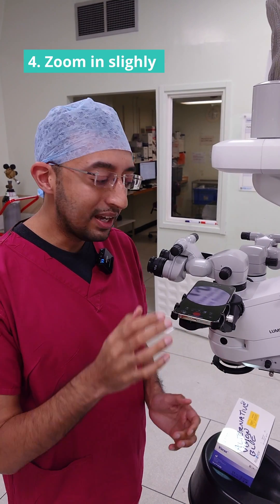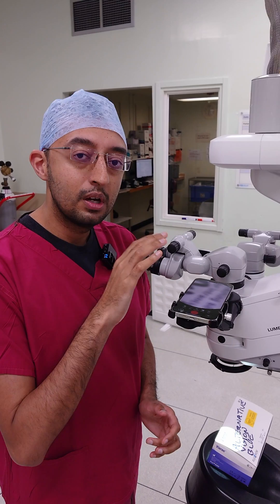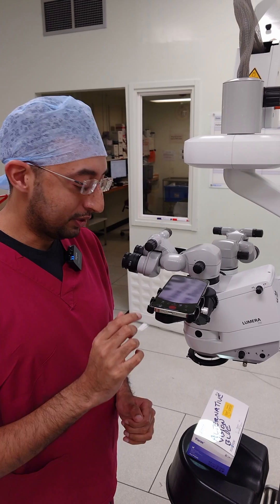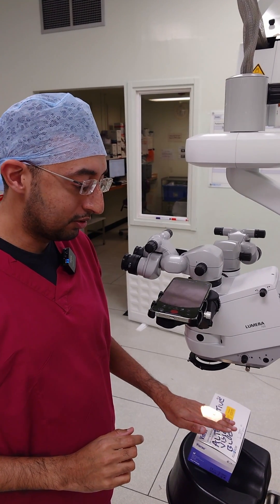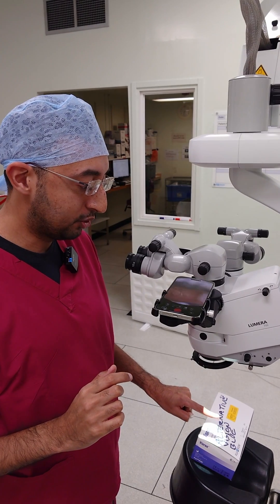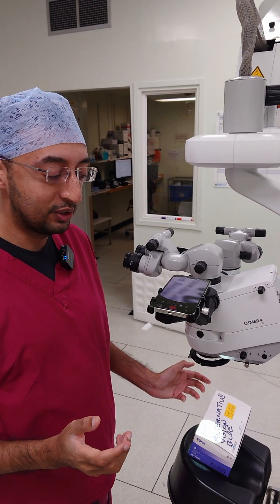Once everything looks good, I like to zoom in slightly just so that the full field of view covers the entire screen. The next thing we need to do is make sure that everything's orientated — this is going the wrong way, so we actually need to rotate the video. I'll put my finger underneath there — it's moving right and then left, up and then down. That looks good.